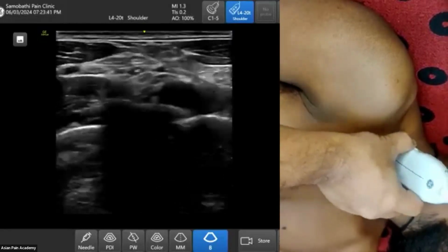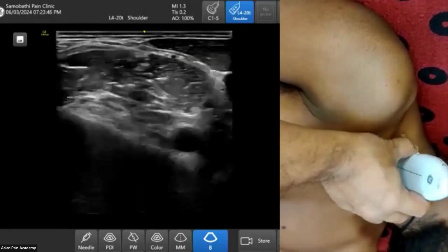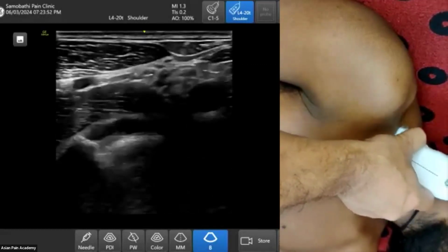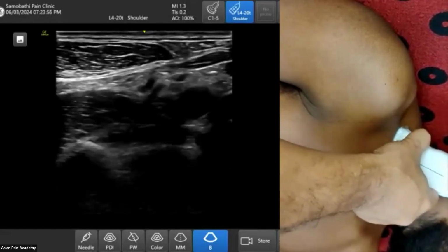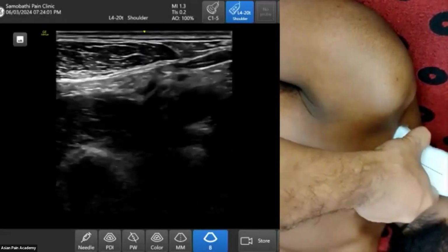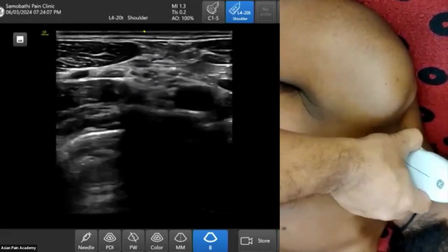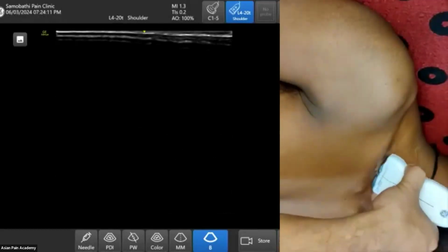Okay, actually you can see one nerve goes outside, but that will be too much. Here the suprascapular nerve actually comes out from the brachial plexus. It is just going outside from the plexus. Now again it has come and joined. Now it is going out. So under the omohyoid muscle, this suprascapular nerve goes from here. Okay, so this is one way of doing brachial plexus block.